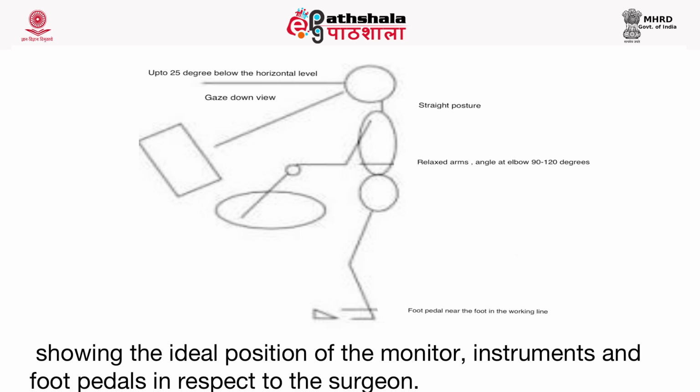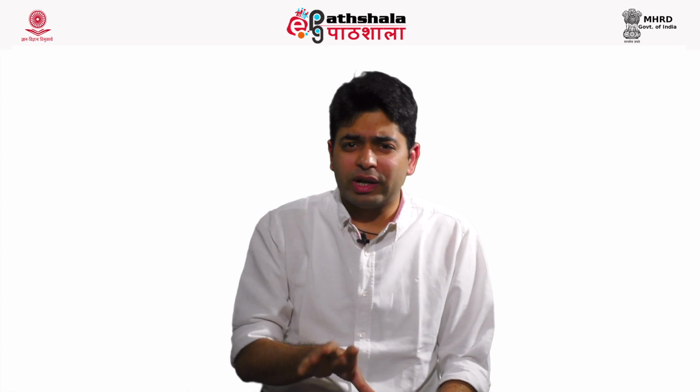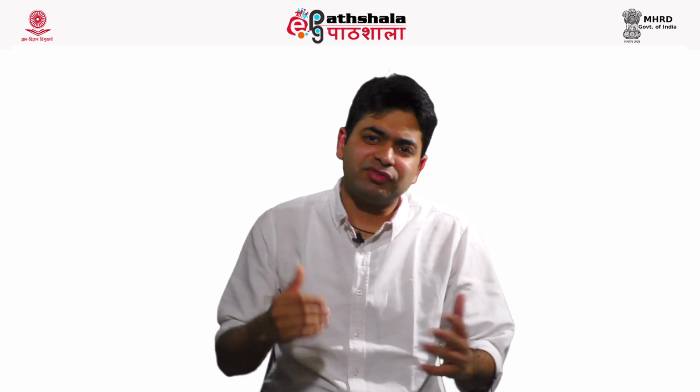Now another thing is known as the gaze down view. The panels earlier were located not in the straight line principle, at some other place. Also they were located at a height. The consensus which has been reached is that the panel should lie approximately 25 degrees below the horizon, 4 to 8 feet away from the surgeon's eyes, so that it appears that the surgeon is gradually gazing down upon the panel. So that should be the prescribed location of a panel. Another thing is known as coaxial view, but then again it matches with the straight line principle.